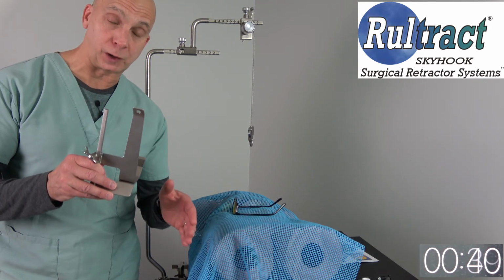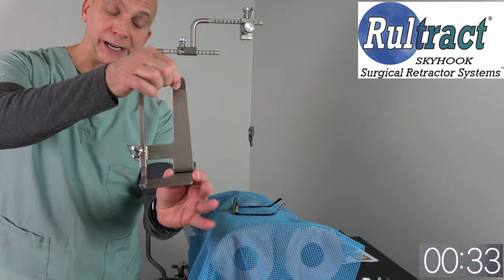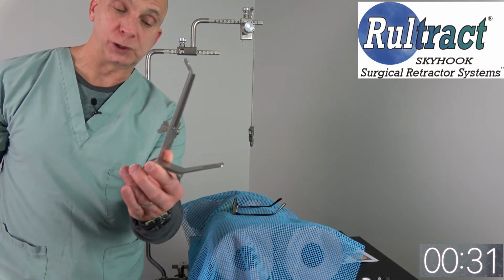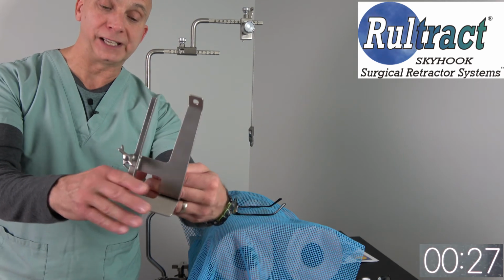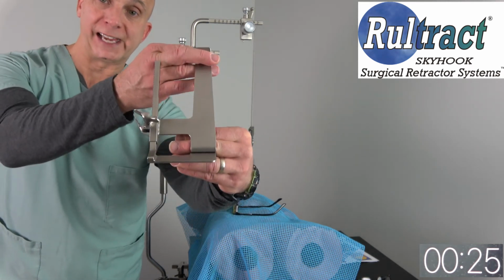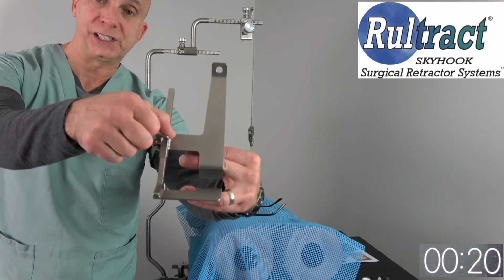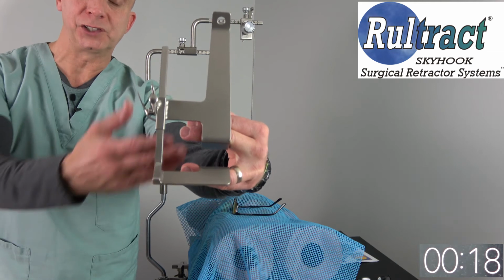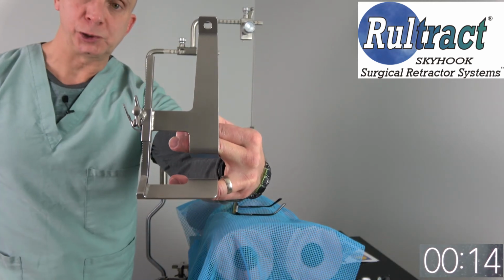One thing I forgot to mention was a new retractor design that we have that's been used for pericardial windows as well as other incisions and procedures. This retractor would simply attach to the Rultract as well. This side would go into the pericardial windows incision. Once it's in place and the Rultract elevates it, you would turn the side rack here and you can see that it will actually open the incision by lifting and pushing the additional tissue away.